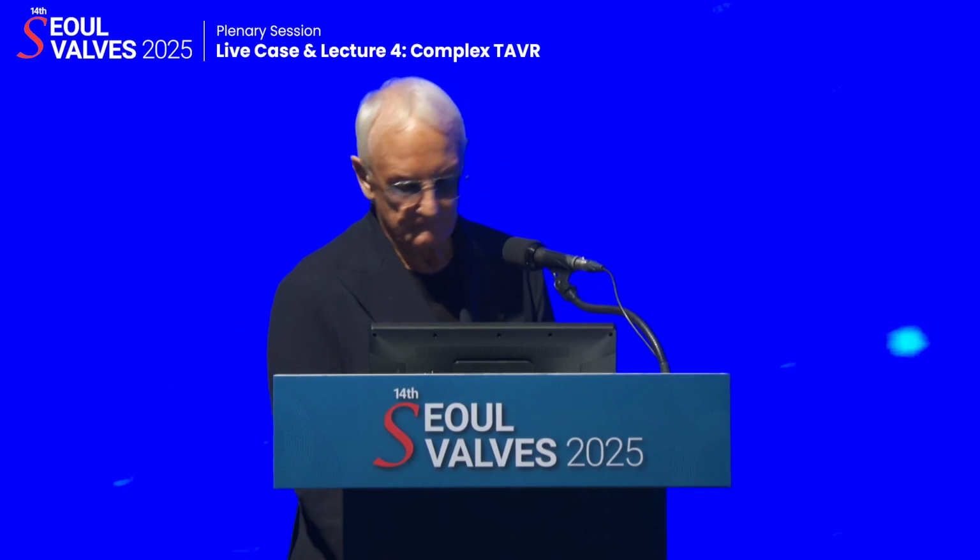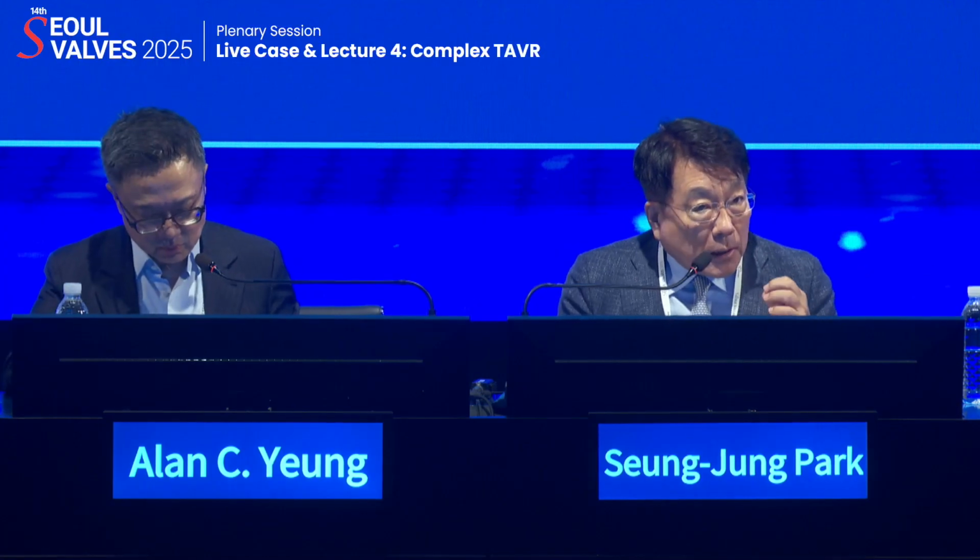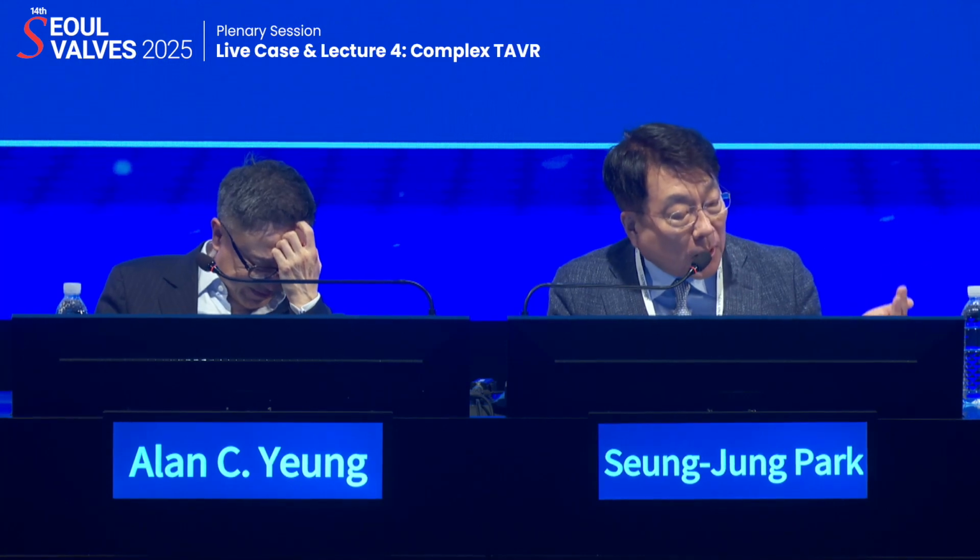Yep. Thank you very much, Eberhard. Yes, I have a simple question for Dr. Yamamoto. I saw the UNICORN case yesterday. What do you think about transcatheter leaflet modification, UNICORN and BASILICA? Do you believe in that first?